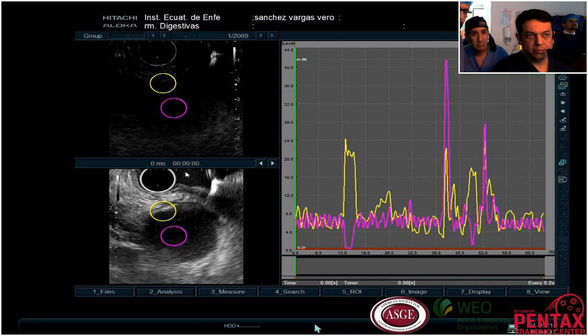We can see here how the captation of the contrast was during this period of time, and we can see also the hypercaptation area in one moment. Esta es la que está más ancha. So this can give us some ideas.